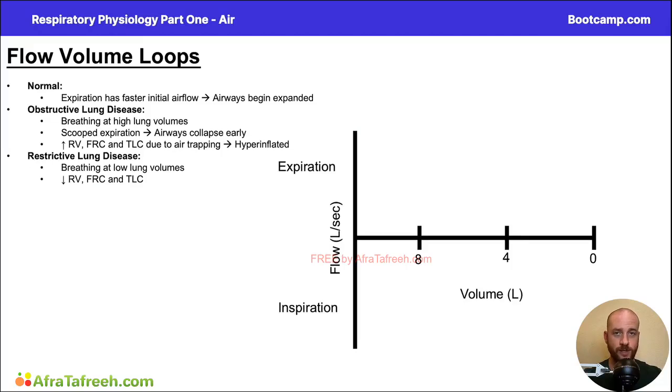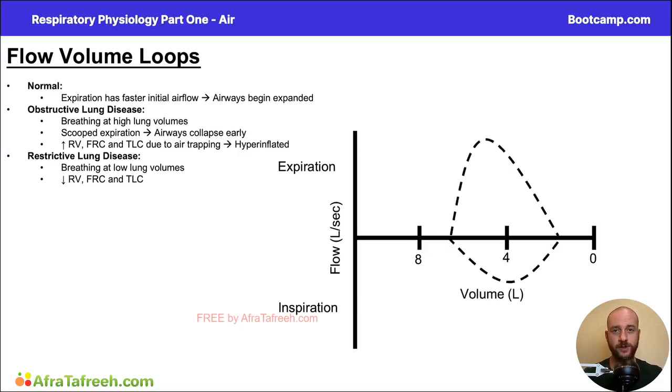All right, so usually when we're discussing flow volume loops, we're not talking about passive respiration. Usually what we're doing is we're plotting forced inspiration and forced expiration. So let's plot our normal curve now. Here's our normal curve, and first we're going to start with inspiration.